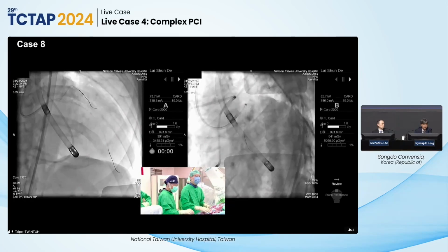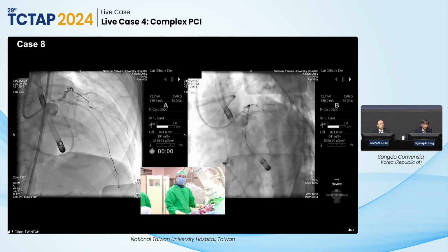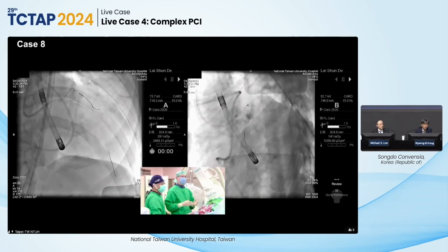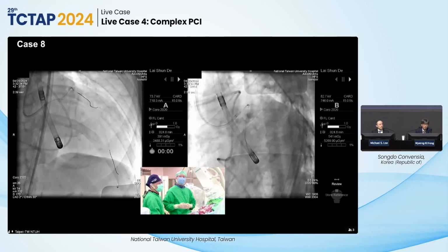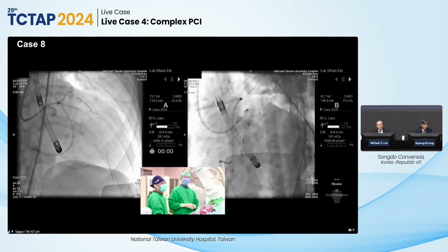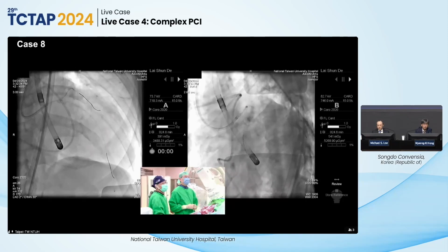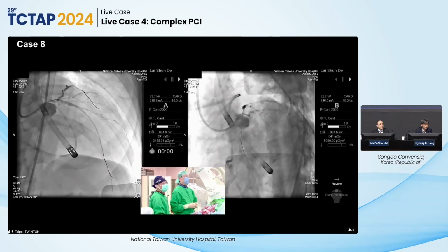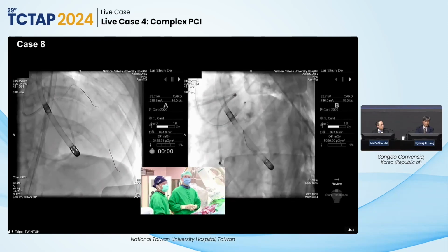Yeah, I totally agree. In my plan, I just try to keep it simple. Initially, my plan was to put a stent to fix the main LAD and circumflex as well. But since we would only fix the proximal part, and distally it was really diseased, it doesn't make too much difference if we put a stent into the main circumflex. It's just putting a lot of metal in the main. So I agree that maybe this time we just do a provisional procedure. We put the main into the LAD, maybe the proximal part, from the angiogram just proximal to the diagonal, just make it a simple procedure.